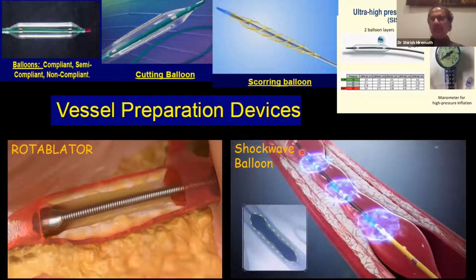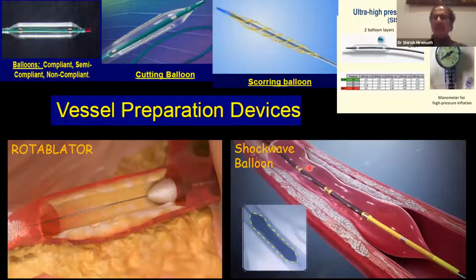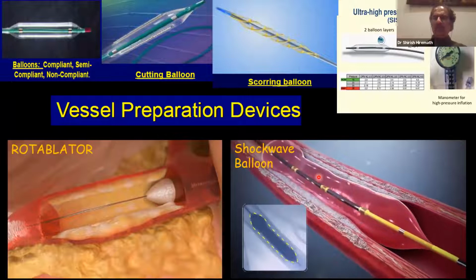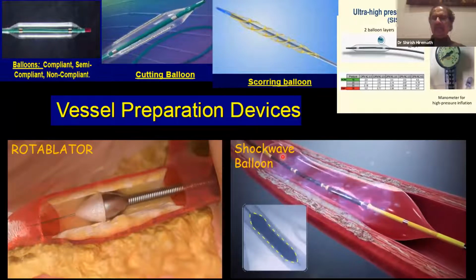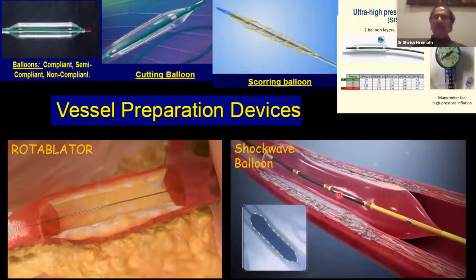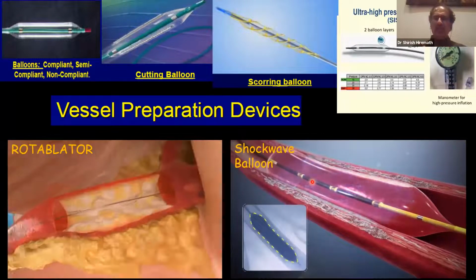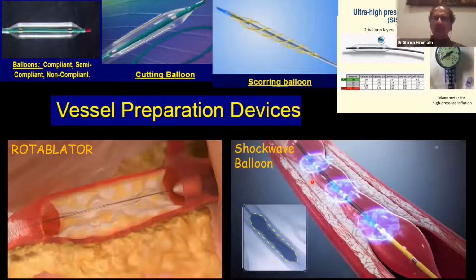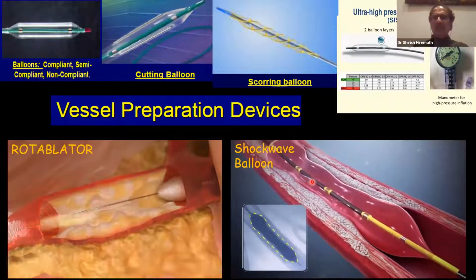You take it just like any other balloon with some degree of bed preparation. You inflate the balloon to 4 atmospheric pressure. And this length at the moment is 12. And you have sizes going from 2.5, 3, 3.5, 4. So these are the different diameters that are available.